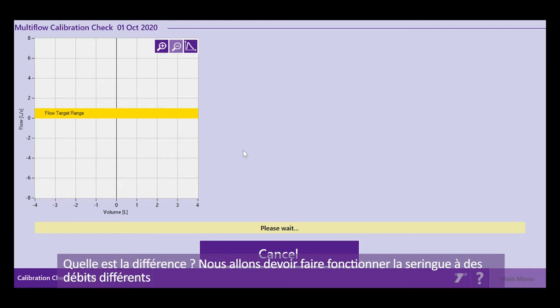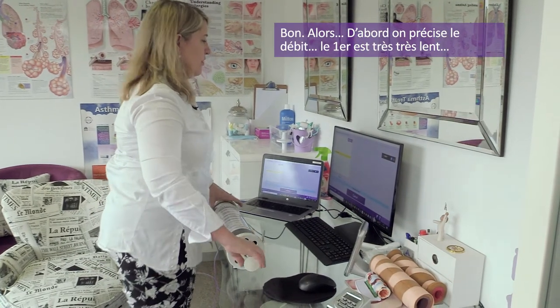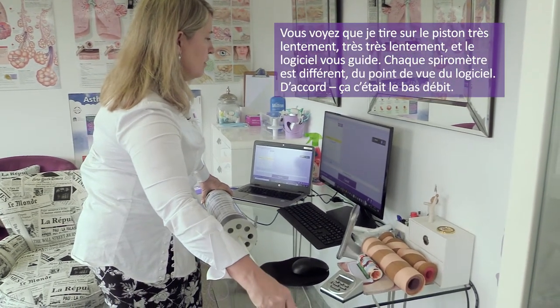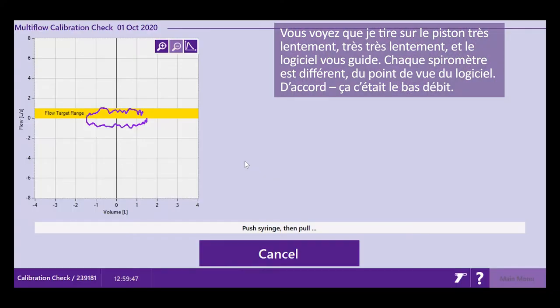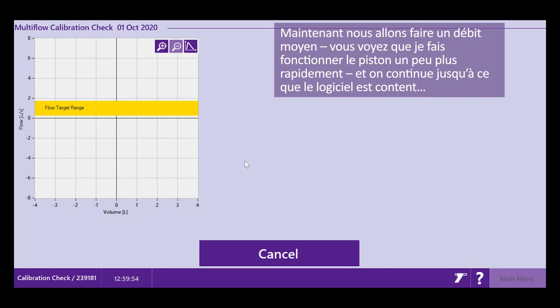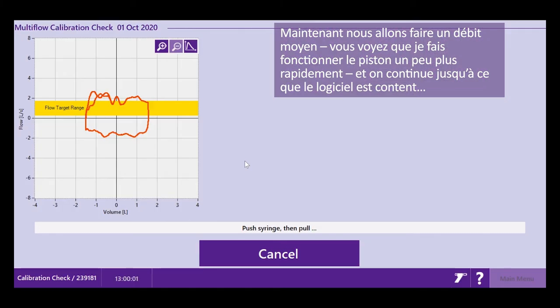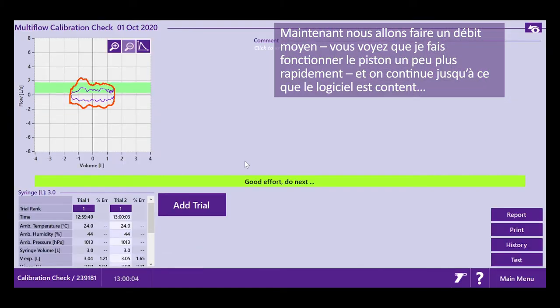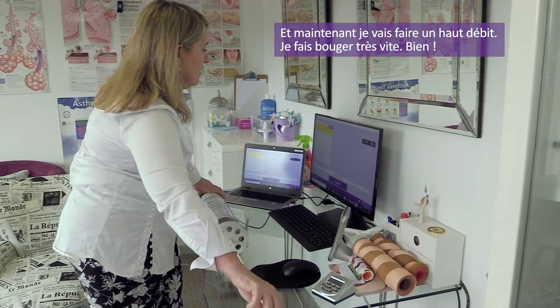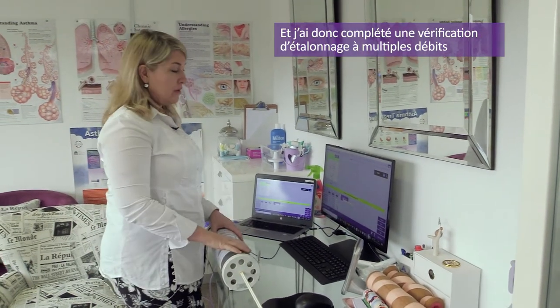How does multi-flow differ? We now need to move the syringe at different flow rates. First, set the flow. My first one is very, very slow — you can see how slowly I'm moving the handle. The machine gives you guidelines. Then I do medium flow, moving the syringe handle a little more quickly. And now I do a high flow rate — you'll see I move the syringe handle very quickly. I now have a complete multi-flow calibration check.